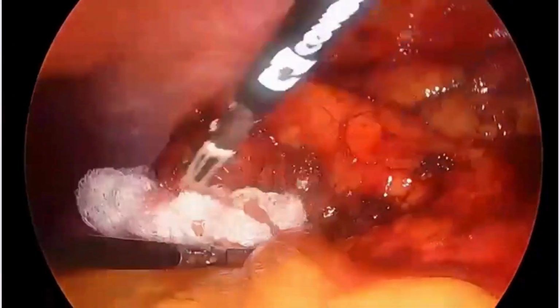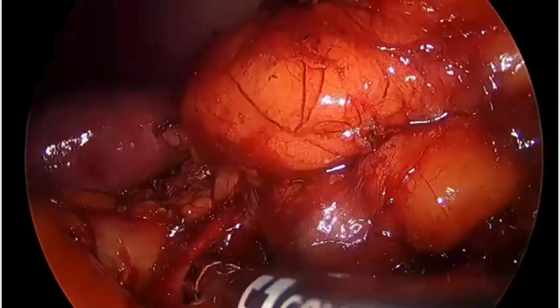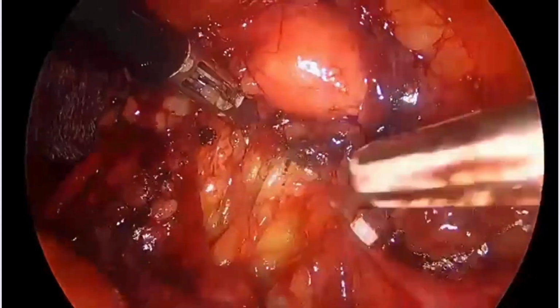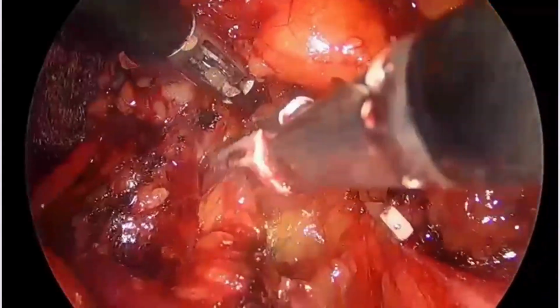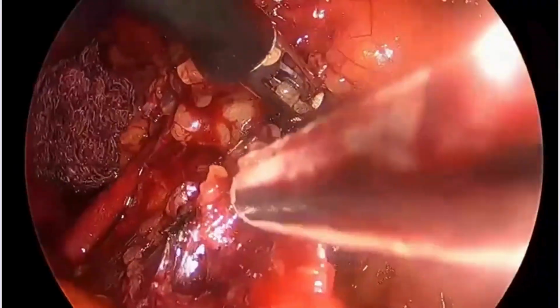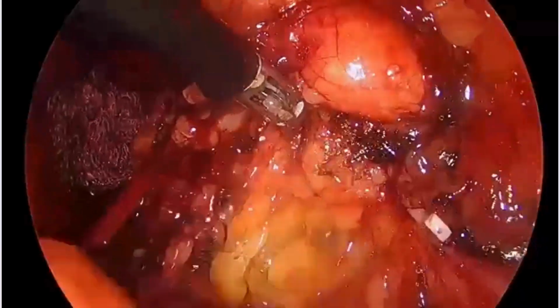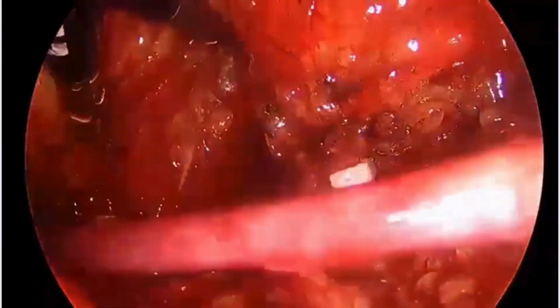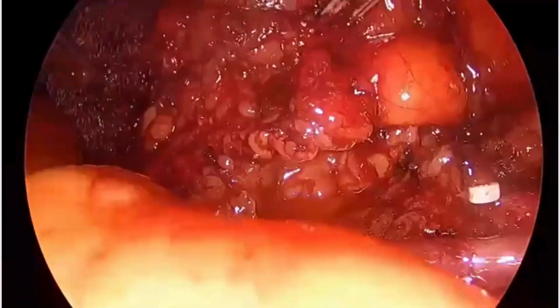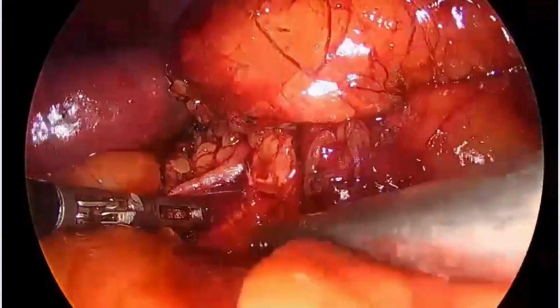And because we could not get that good leverage to lift the kidney, we had to dissect it some more cranially towards the spleen, and then slowly started going towards the hilum. And after a while, after doing some more dissection with the help of ligature, we started seeing a cord-like structure behind the renal vein. And this was the first glimpse of the renal artery that we could see.